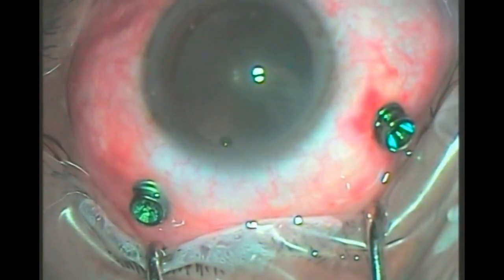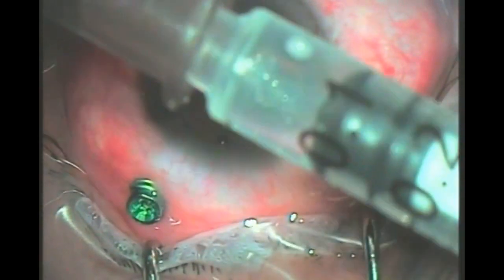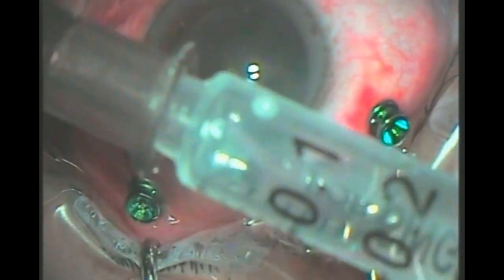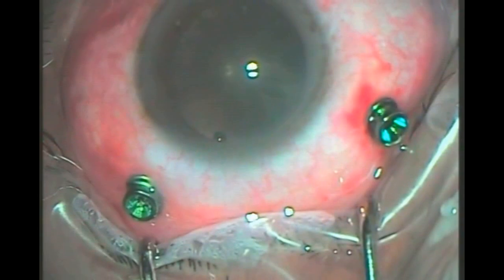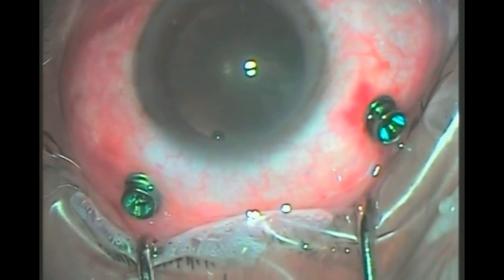After this, we take the help of bubble-assisted anterior vitrectomy to clear up the leftover anterior vitreous safely. We take a 1 ml tuberculin syringe for this procedure and fill it with 0.1 ml of BSS solution. Then pull the plunger back to allow another 0.1 ml of air into the syringe.